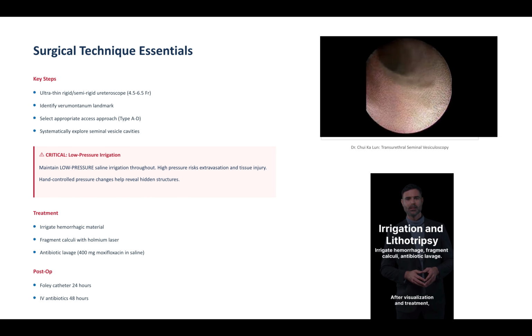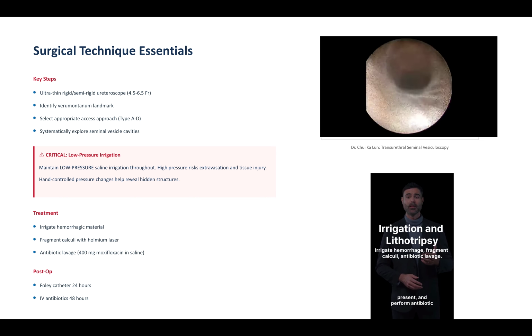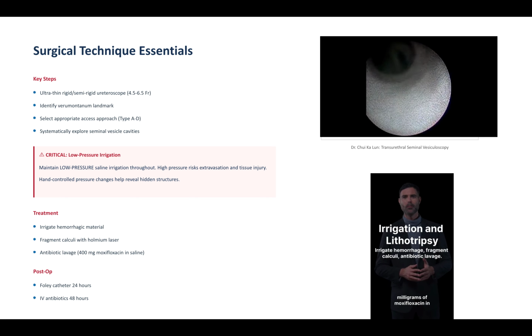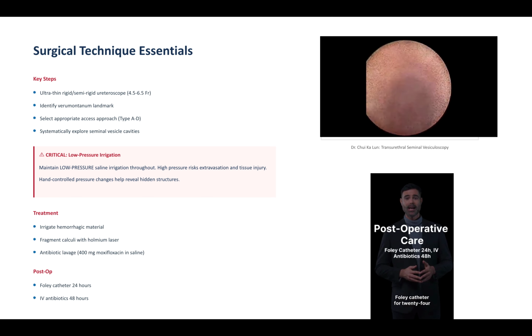After visualization and treatment, we irrigate any hemorrhagic material, fragment calculi using holmium laser lithotripsy if present, and perform antibiotic lavage with 400 milligrams of moxifloxacin in saline. Post-operatively, we place a Foley catheter for 24 hours and administer intravenous antibiotics for 48 hours.